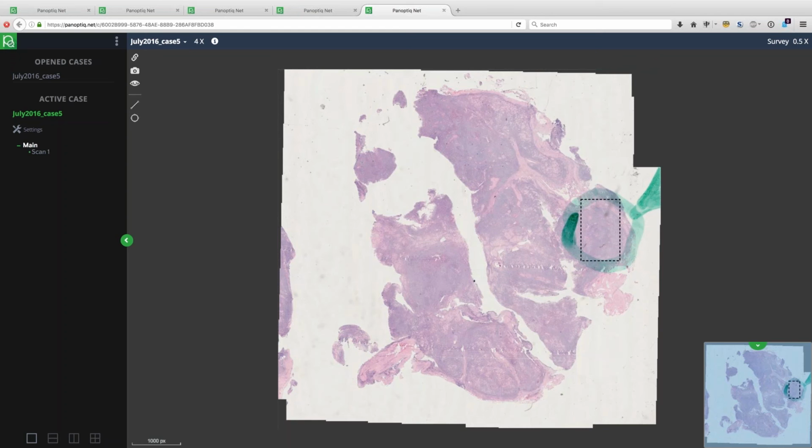Second of all, I can show that there is a nodularity. Now go a little bit higher magnification, Richard, maybe by a quarter. Don't go in that square yet. Just on this low magnification, there we go. So the most important part of this image are these nodules. I hope the participants can acknowledge these nodularities.